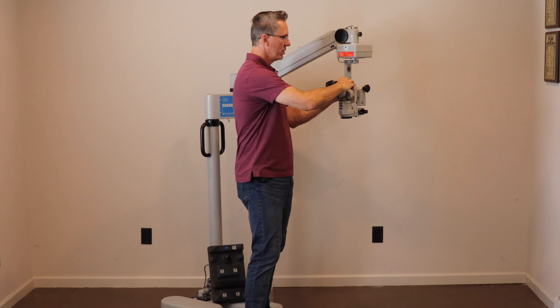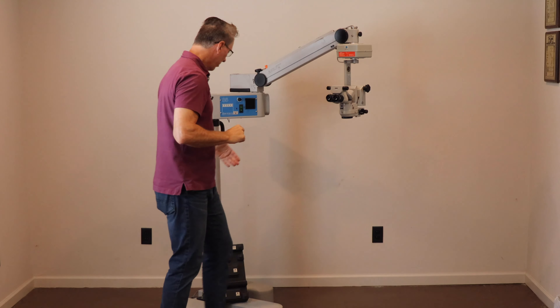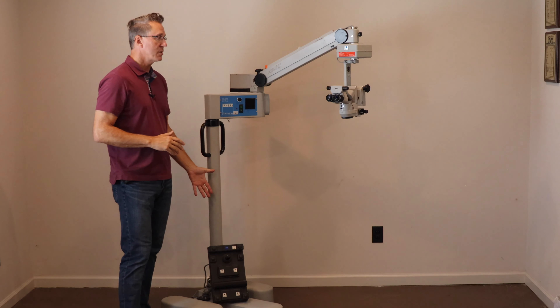It's going to come with an inclinable binocular for the surgeon, an XY with auto center, and a waterproof foot control. You can turn the light on and off with the foot control on the system.